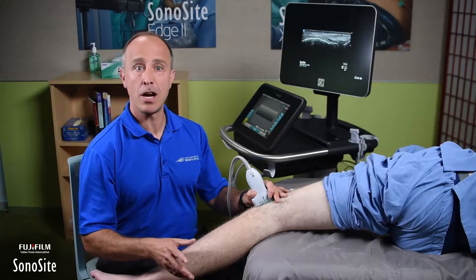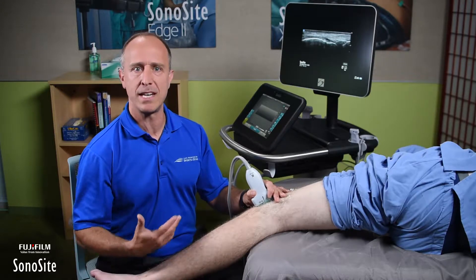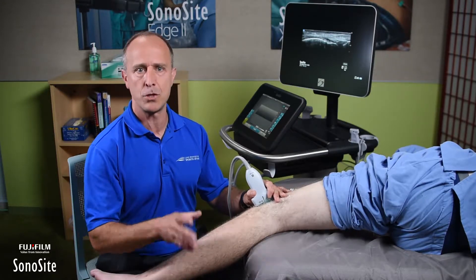I'm Garrett Hyman with Lake Washington Sports & Spine in Bellevue, Washington. I just want to take a moment to talk about ergonomics — how you want to set yourself up, and the patient up, and your machine up.